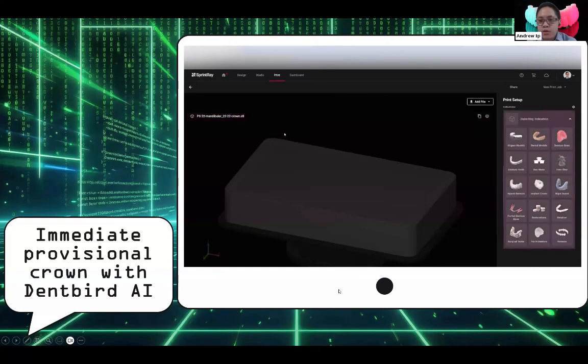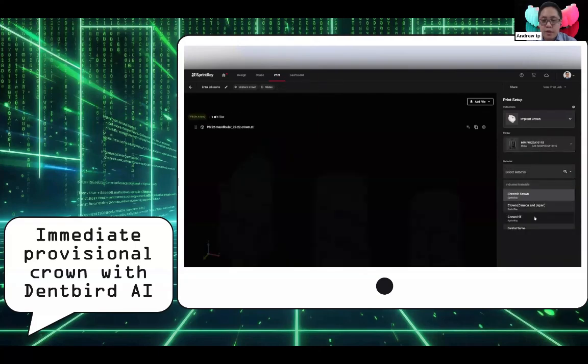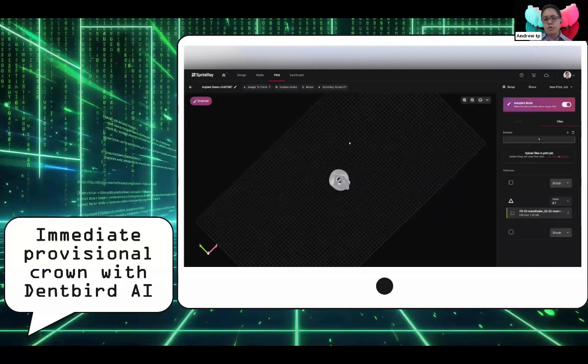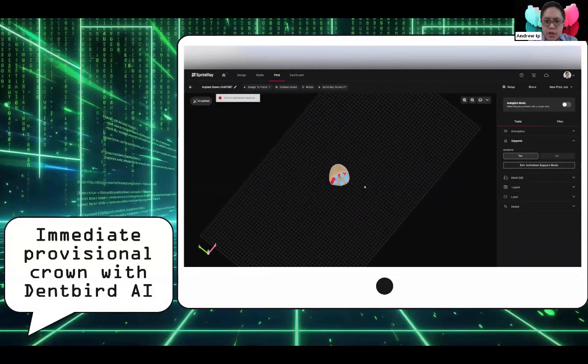So yeah, I'm just loading it onto Rayware, which is a cloud-based 3D printing slicing program specifically for SprintRay printers. And I'm going to be printing it on my Midas out of Crown HT resin. Beautiful material. I think it just got CE approval in Europe, and it's just got TGA approval in Australia.